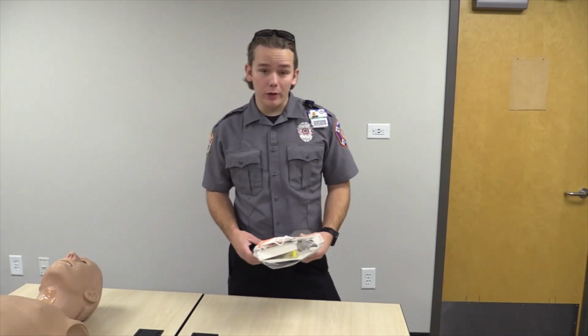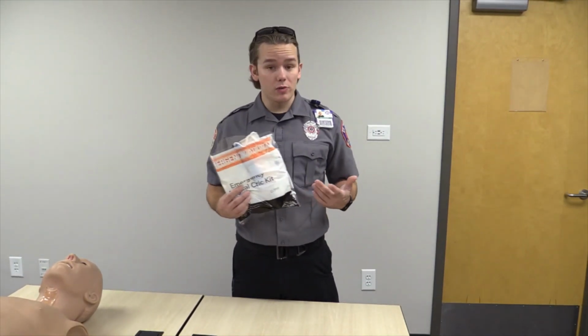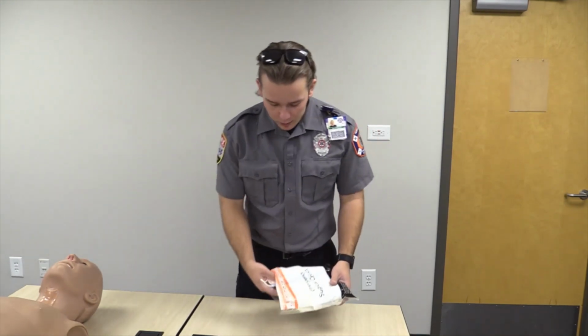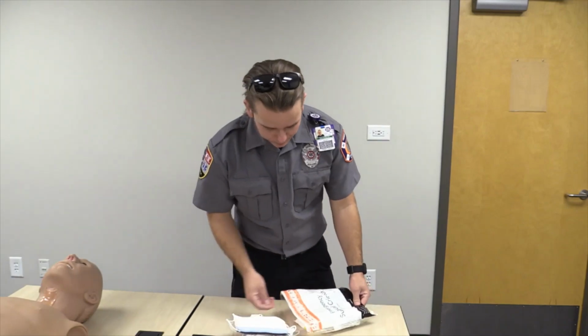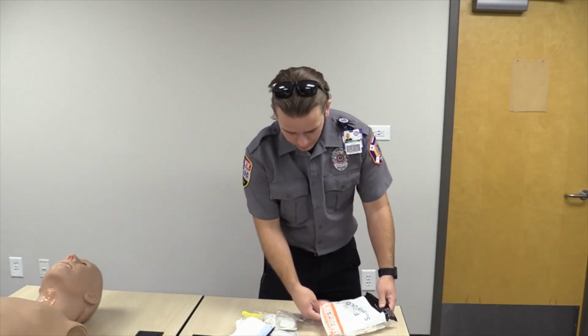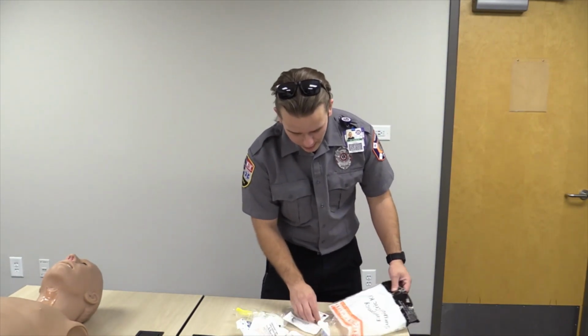So recently we got a new kit for our Cric procedures. What I'm going to do today is we're just going to bust this open and look at each piece of equipment. After we've opened it, we're just going to pull this out, and I just kind of want to show you and walk through what pieces of equipment we have.